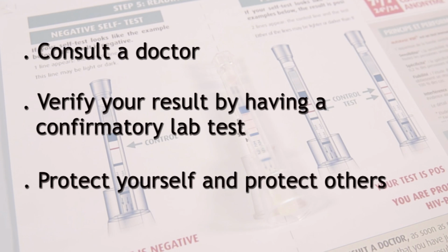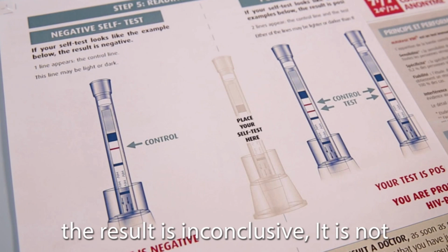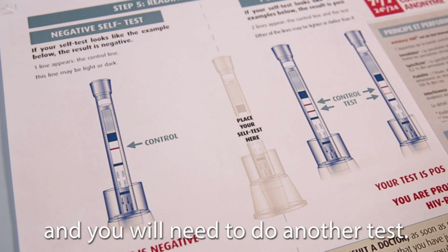Until the results of your confirmatory test, it is advised to use the means of prevention available, male and female condoms, to avoid taking the risk of contaminating yourself or other people. If your results do not look like the above example, the result is inconclusive. It's not possible to draw conclusions from this result, and you will need to do another test.